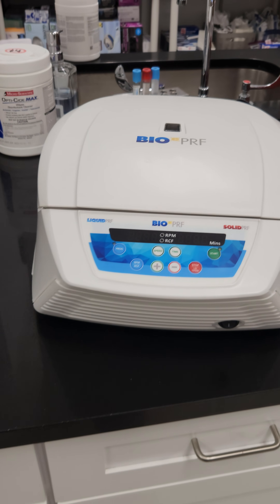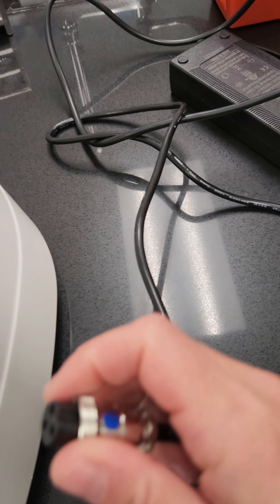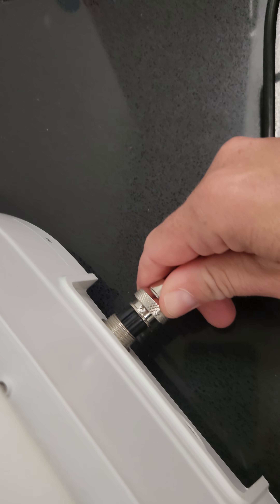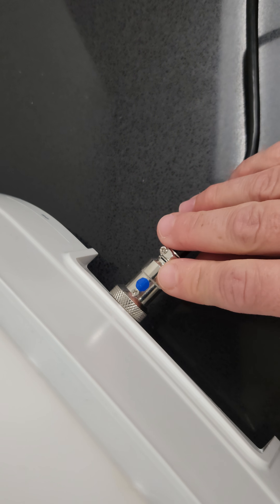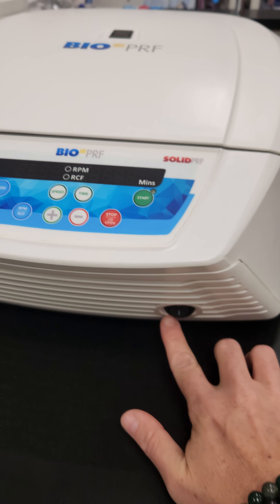Quick overview on how to set up your BioPRF horizontal centrifuge. The first thing you want to do is plug in the power cord. This end has a notch and that notch is going to go facing up right into the back here. It should slide right in smoothly. Also notice the blue dot on the top there facing up. Once that's screwed in all the way, you can plug this into the wall and then turn on your centrifuge right here.